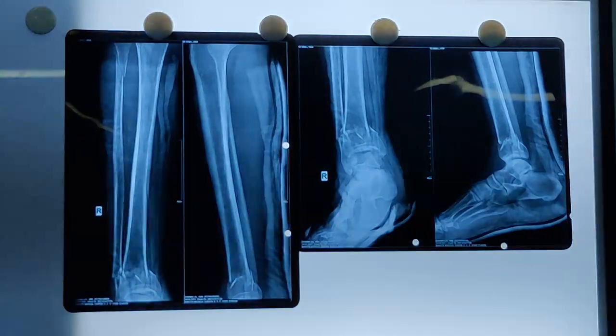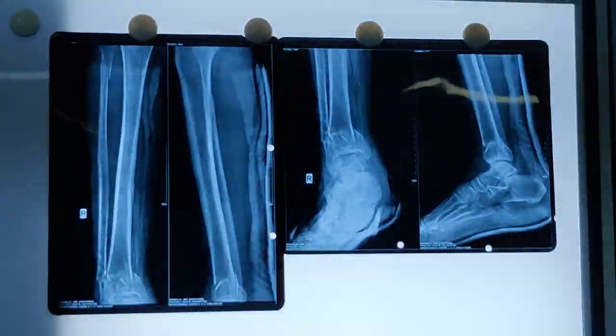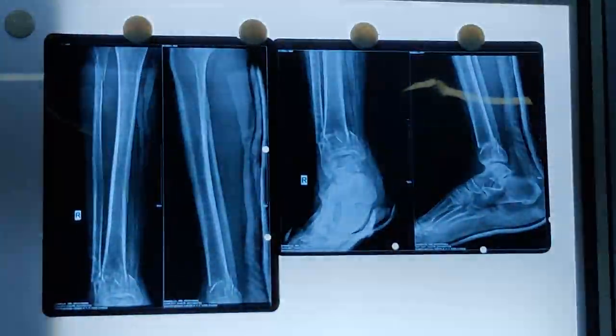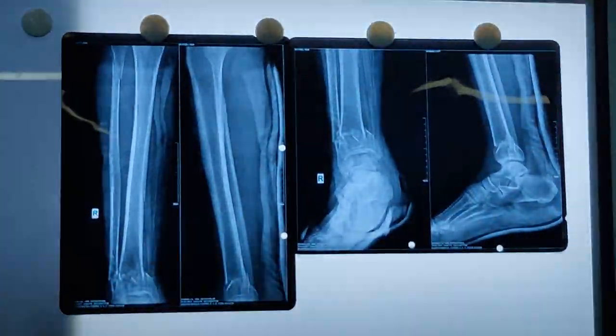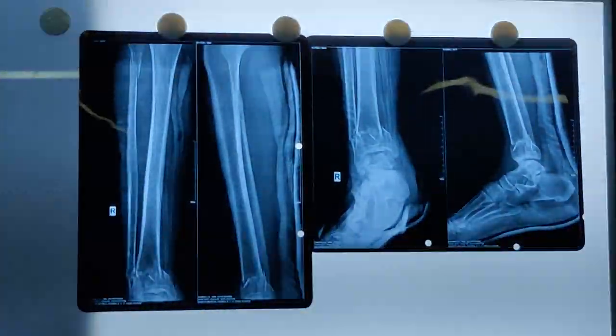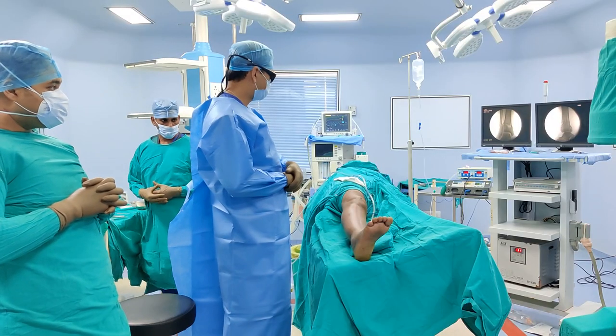Our patient today is a 59-year-old gentleman who had a road traffic accident and has a multifragmentary fracture of the distal tibia as well as the distal fibula. The injury is closed. We aim to do a percutaneous plate fixation of both tibia and fibula, and I will take you step by step through how to do it.